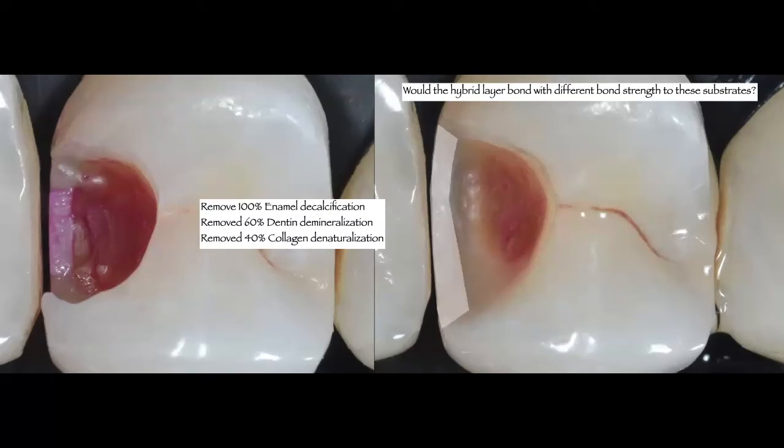So again, what you're seeing here is that white layer of enamel, and I'm just going to color all these layers for you so that it's easy to identify. Now I have that DEJ. A beautiful, clean DEJ, which is in between the enamel and that 1 to 2 millimeters of inner dentin that is nice and clean, which I'm going to call now my peripheral seal zone.